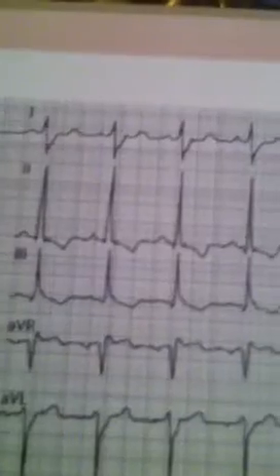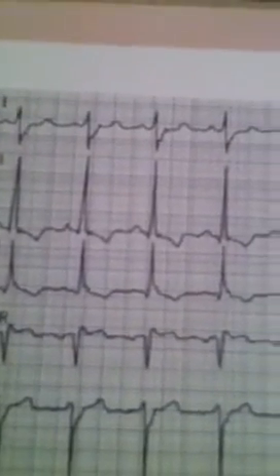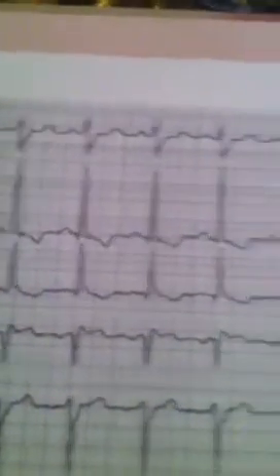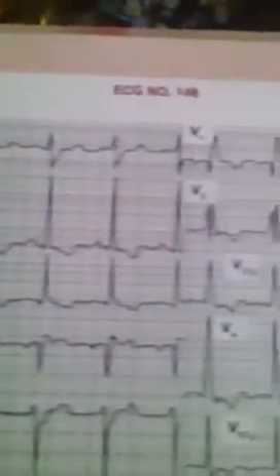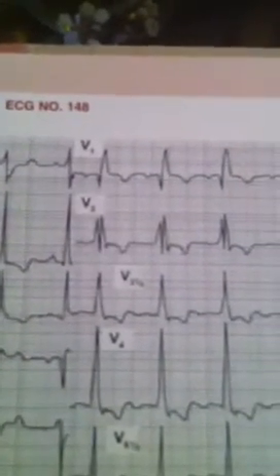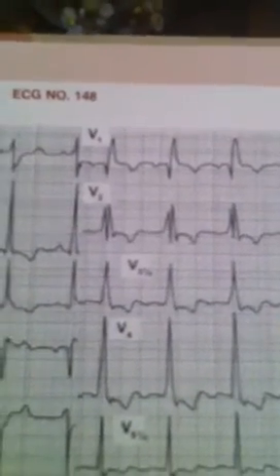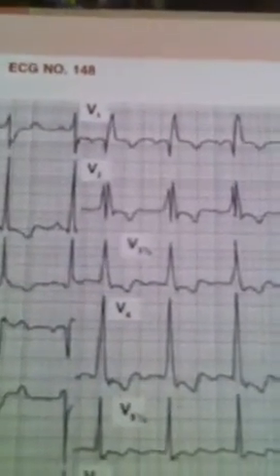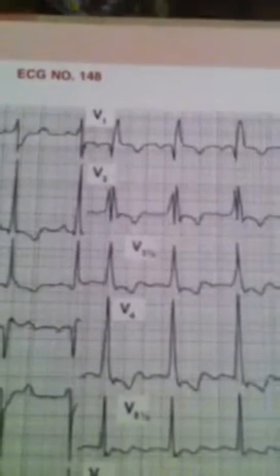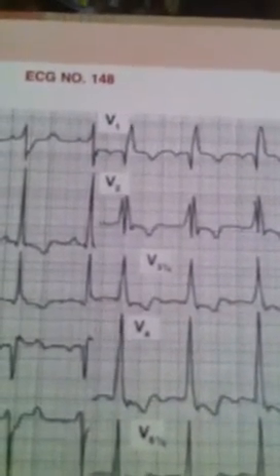This means there is a posterior hemiblock. Going to V1, the RSR' pattern indicates right bundle branch block. Also note the M-shaped R wave in V2.